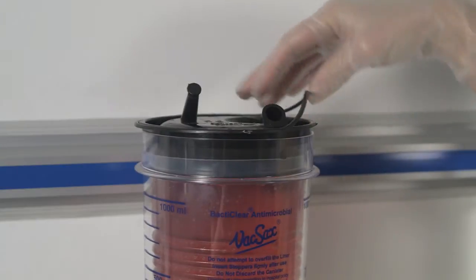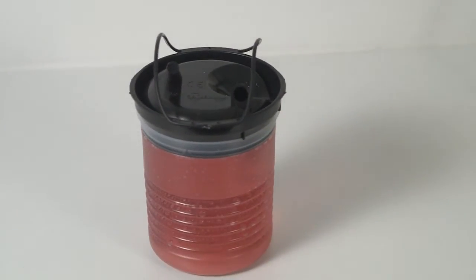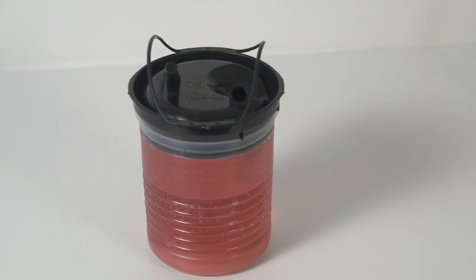Using the convenient handles located at the sides of the liner, remove the liner from the canister. The VacSax BactiClear antimicrobial liner stands upright when full of fluid for convenient and safe disposal.